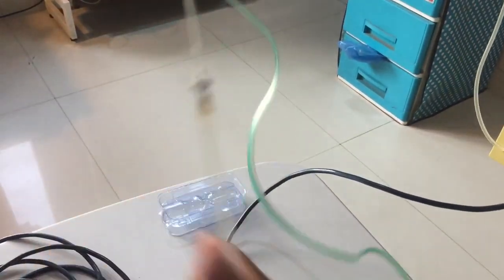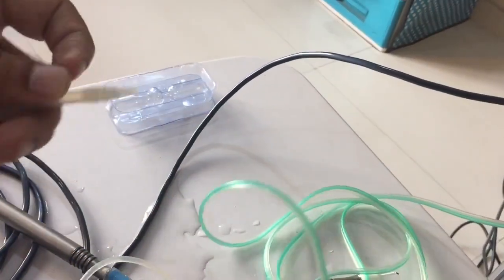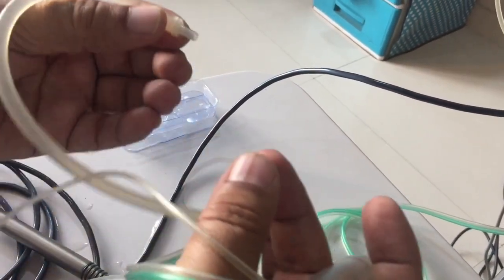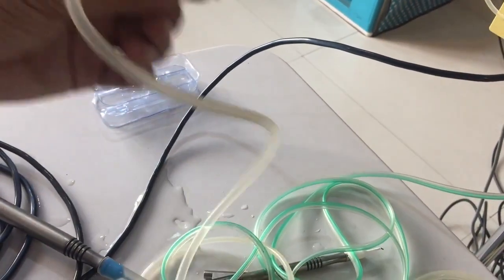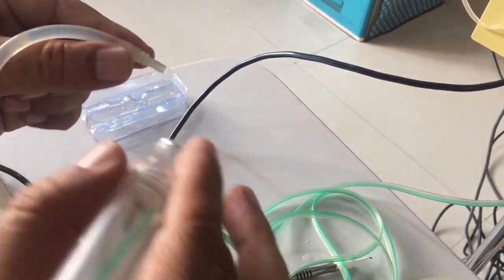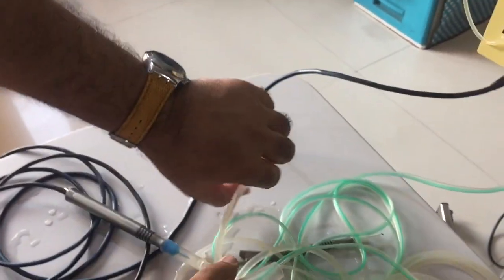Our cutter is ready. The aspiration port, the irrigation port, you can use a second port, the side port. You can connect here the Simcoe cannula or any handle which is used to deliver the irrigation in the eye. So in this way, the vitrectomy will work with the foot pedal.